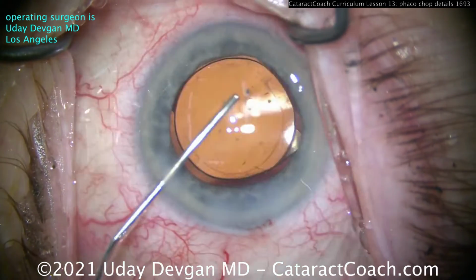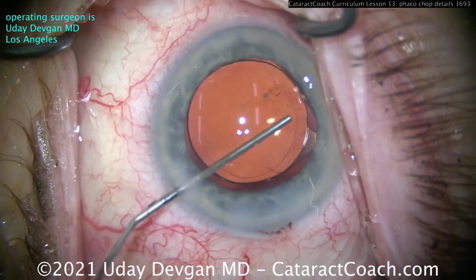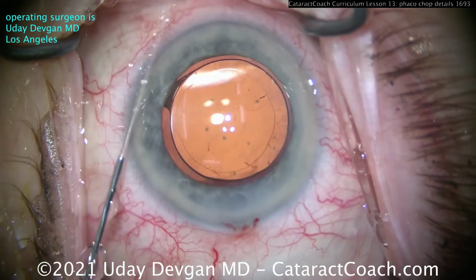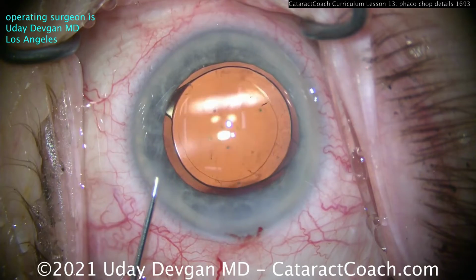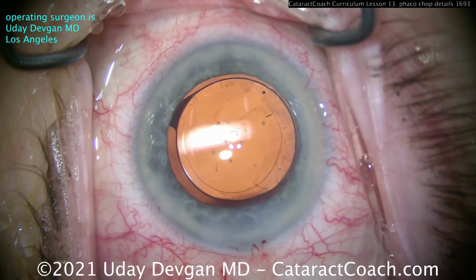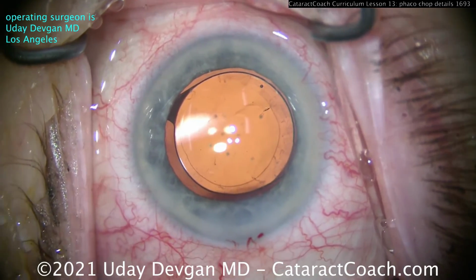Remember, it's not just about the ultrasonic energy. If you run 500 cc's of fluid through the eye, you're going to really surprise and hurt that corneal endothelium. So you want to minimize the surgical fluid that's used during surgery, the BSS, the amount you run through the eye. And that looks great.